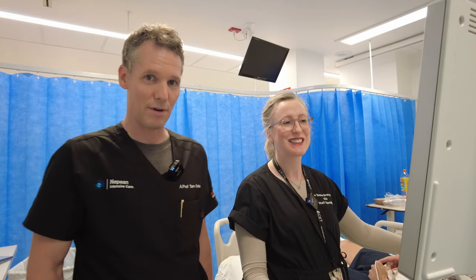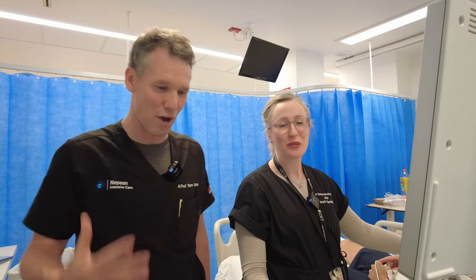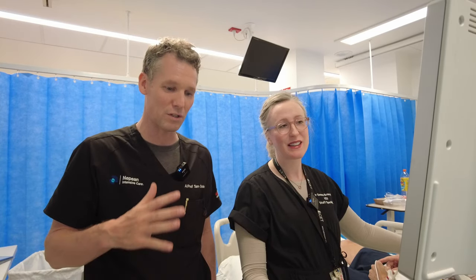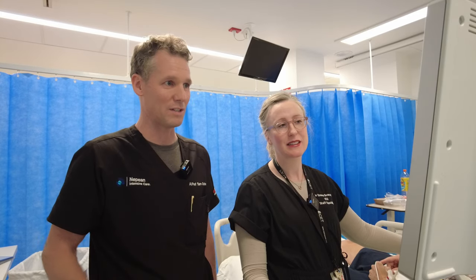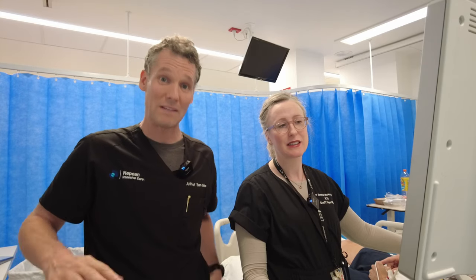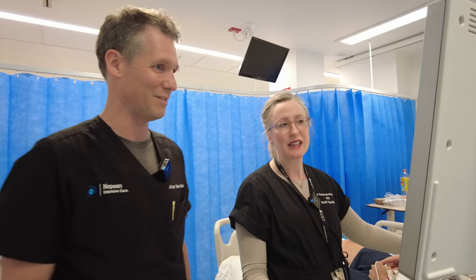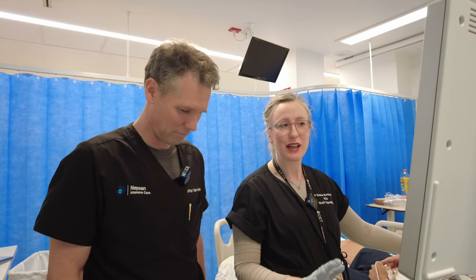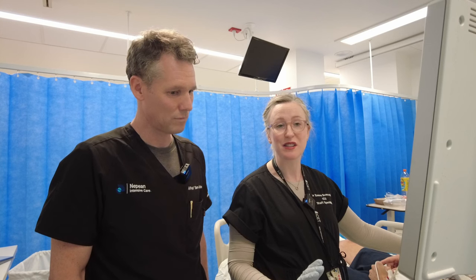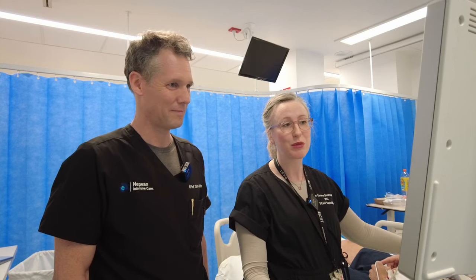Emma is going to scan this patient and give us an overview of how we can try to elucidate the anatomy and piece together exactly what the anatomy is. A big preface to that is that this is adult congenital heart disease for intensivists — so this is going to be pretty basic, but we'll cover some of the main things.